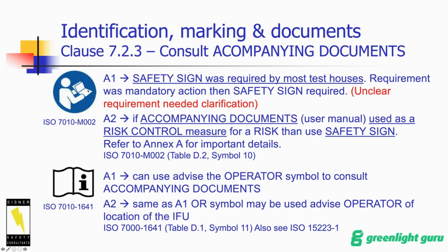So instead of using this symbol, on a medical electrical device, and most medical devices, you're almost always going to have this symbol because of 15223 anyway, and other requirements. And most notified bodies push you into this from what I've seen. So it's likely you're going to have this symbol. And when I've seen medical electrical devices, I typically see both of these symbols because your test house has almost always pushed you into this.